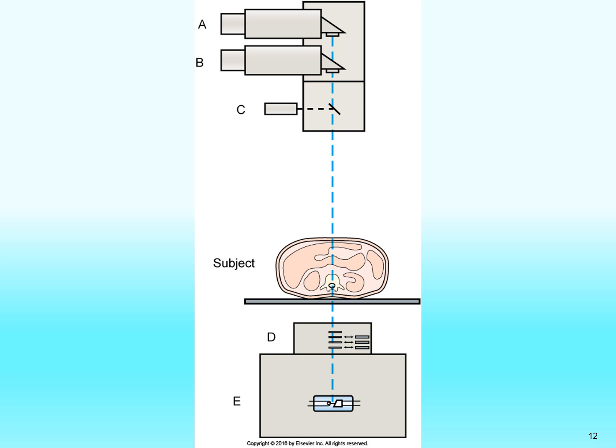At level D, underneath the patient, we have a series of filters. So aluminum, copper possibly, multiple, and so when we set up the protocol, the machine should set appropriate filtration automatically. Technologists shouldn't be deviating from the software protocol, unless they are doing something special, and so the machine should control what filtration goes in and what filtration doesn't. And there might be a difference in filtration between the high energy and the low energy beam. Okay.